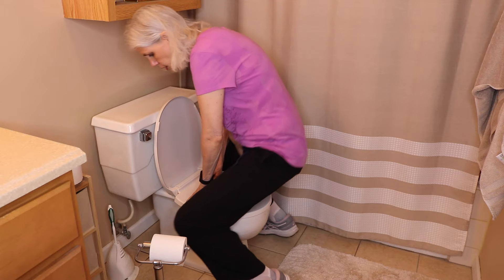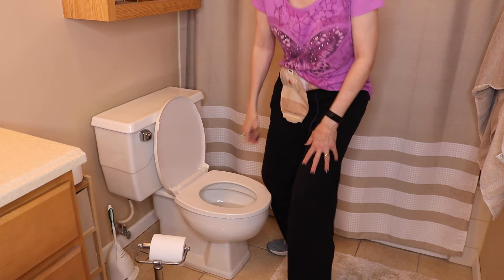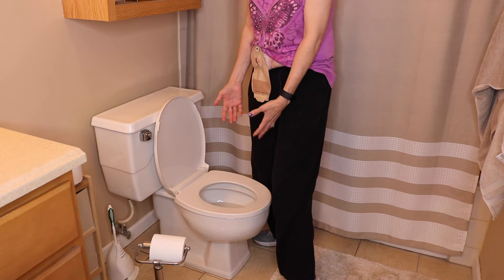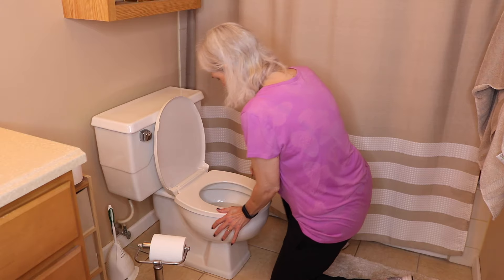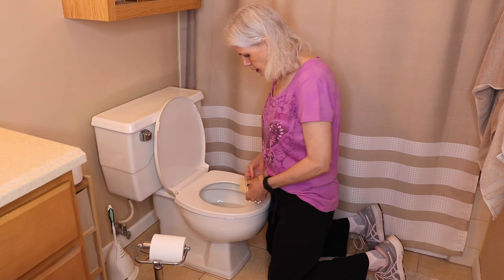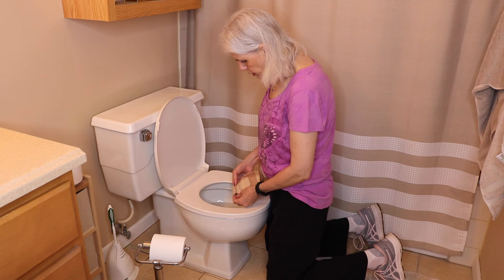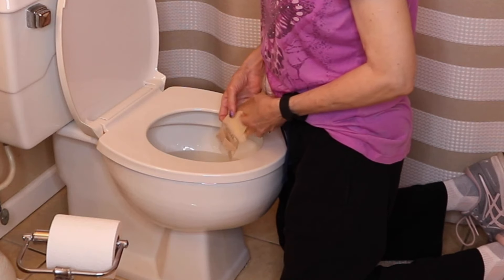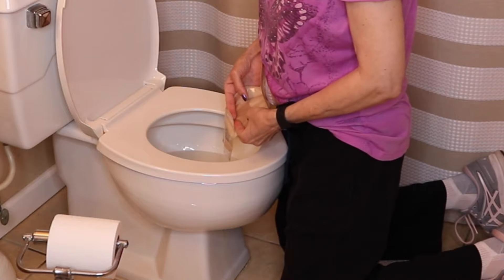Sometimes if you're short enough you can stand and empty your bag in the toilet, but again you'll have that splash factor. Another option is to kneel in front of the toilet — depending on how tall or short you are — get your bag inside there, open it up, hold on to it, and drain it out. If the contents are a little thicker, you'll have to take your fingers and run them down to help squeeze everything out.